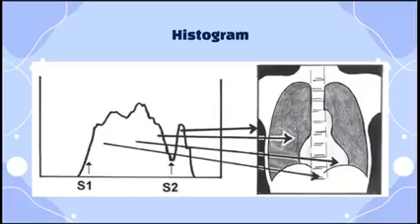For most applications, the computer must recognize the area from S1 to S2 and analyze only this information in processing the image. So the computer should only process from S1 to S2, because this area here is of no significant information. Okay? Because of course, they are just black densities, there is no anatomy. Okay?